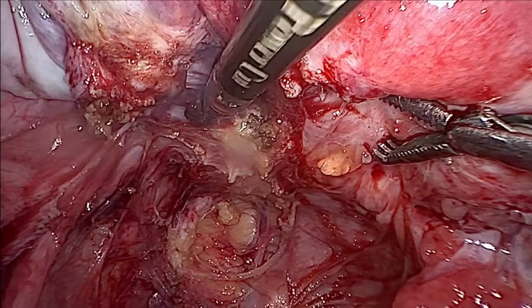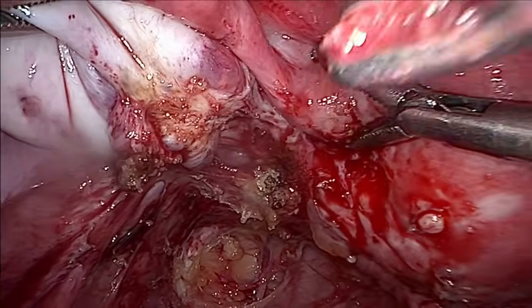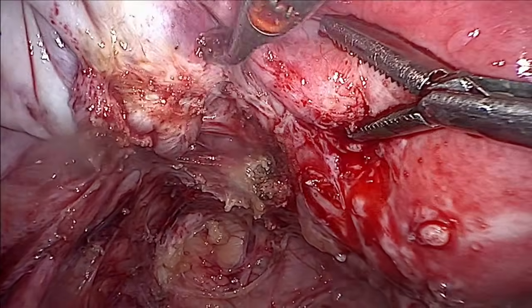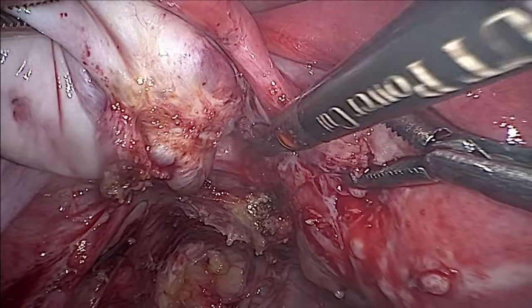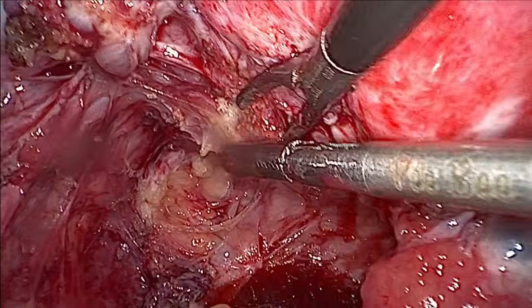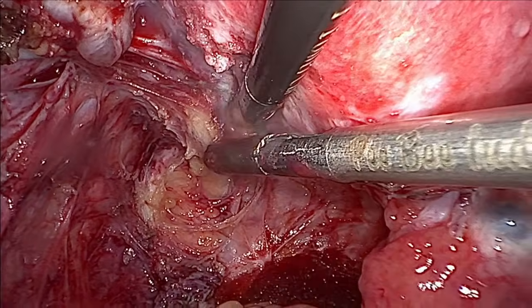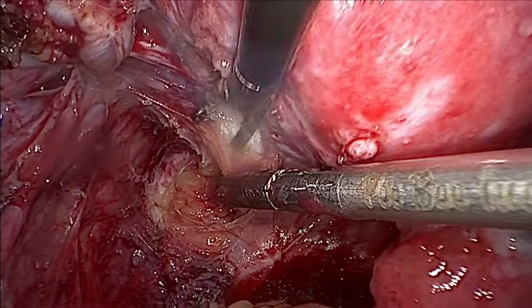Yes, so now we have the ovary which is a lot free. Don't need to cut this. Okay, this is the ovarian ligament here. Okay, you can go here. We can cut this nodule.